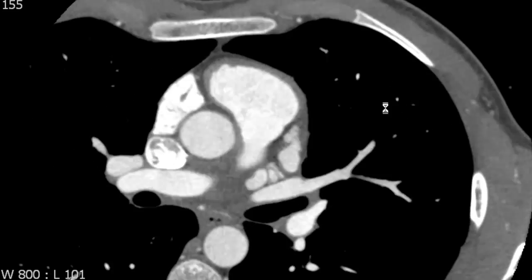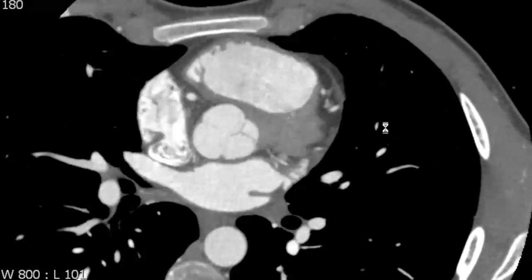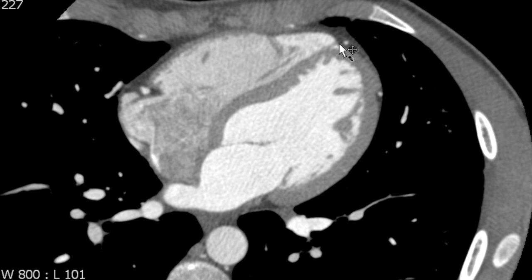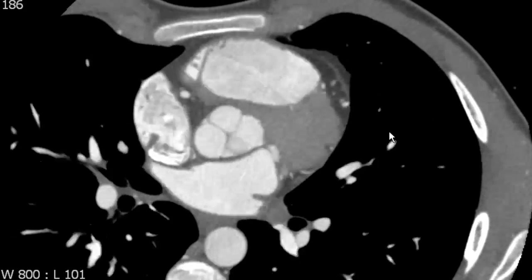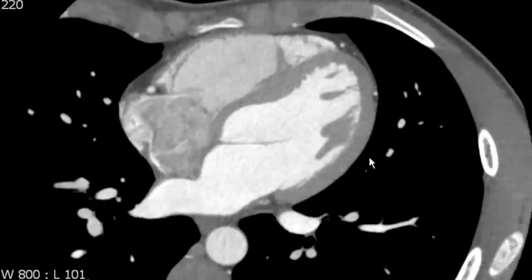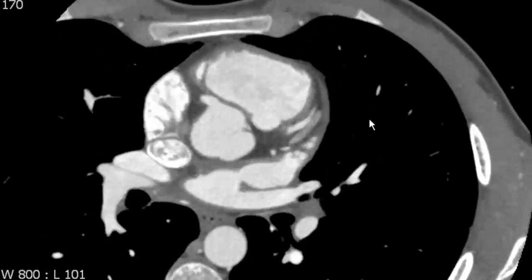Now we're going to talk about the various external landmarks of the heart. The anterior interventricular sulcus lies on the anterior aspect of the heart, and it's this little gull wing contour that we see on the anterior surface of the heart that separates the muscular left ventricle from the relatively thin right ventricle. We can see that there's a blood vessel housed right in that sulcus, and that's the left anterior descending artery.